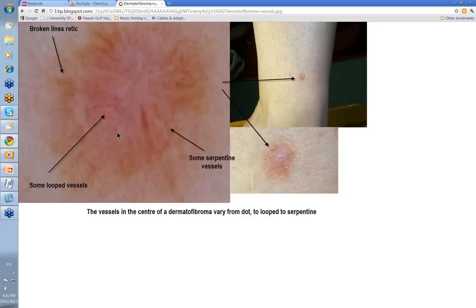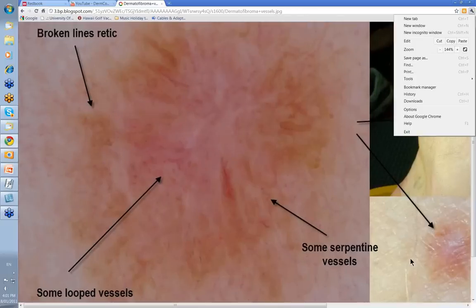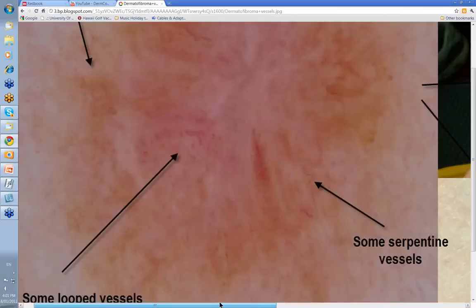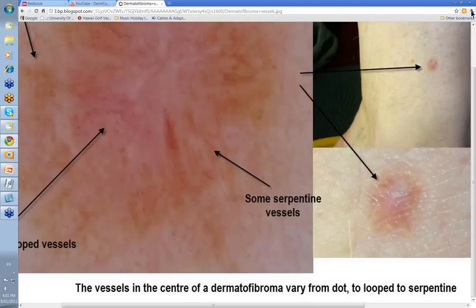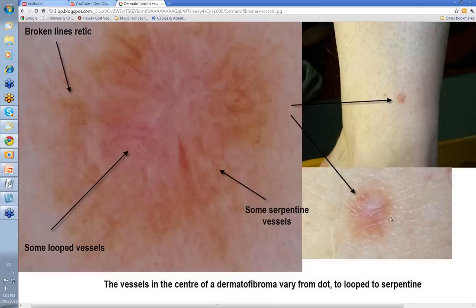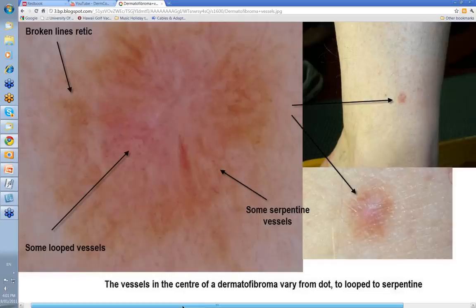This was to show the different types of vessels that you may in fact see. If we enlarge this, you'd see that there are some looped vessels here, and also some serpentine vessels. You don't really want to rely on vessels to make a diagnosis of dermatofibroma. If you've got a very pink dermatofibroma with little in the way of surrounding pigmentation, and there are different types of vessels — especially dot, serpentine, and looped vessels — you just might think that's the pattern of an amelanotic melanoma. And sometimes it can be difficult to say and you need to biopsy.